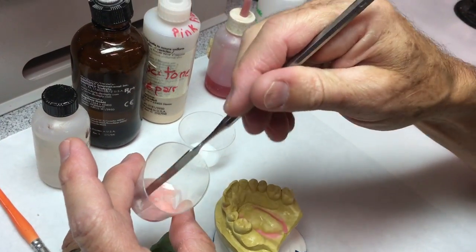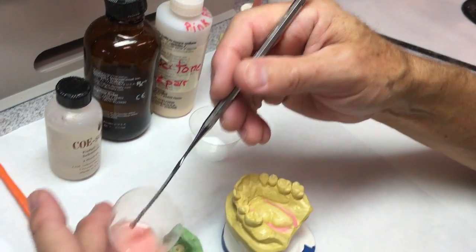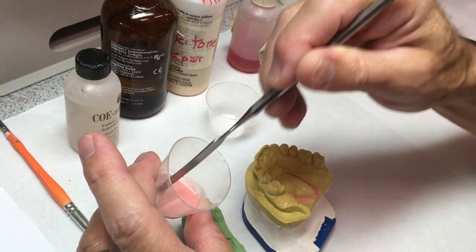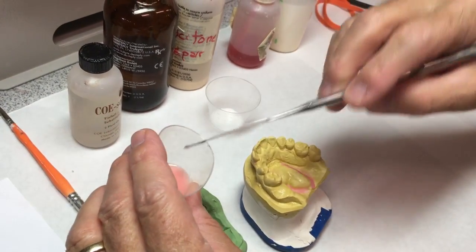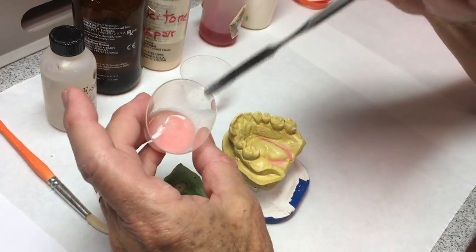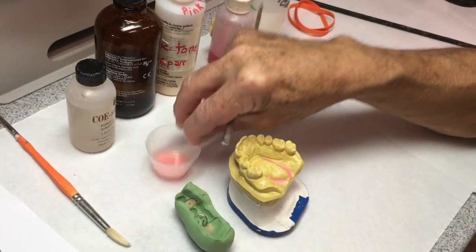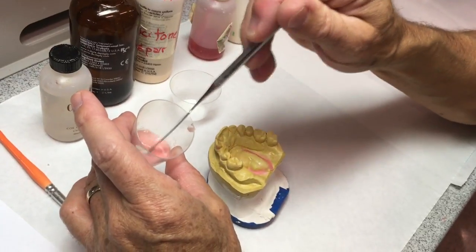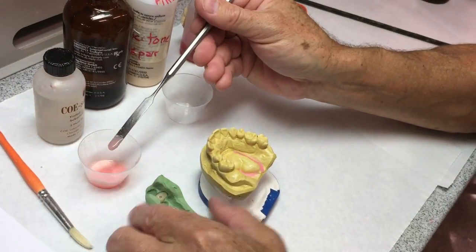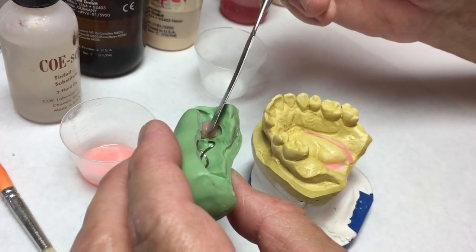I want a consistency about like mayonnaise. We're going to apply it on the edentulous areas and under the putty matrix. If it's too thick, the matrix won't go on all the way — that's bad. If it's too thin, it will run out and you'll have some voids to fill in after. Initially when we mix it up you'll see a few bubbles, so we need to wait about 30 seconds and work the bubbles out. I've drilled a diatoric hole in this canine that I want to be sure to get acrylic in.